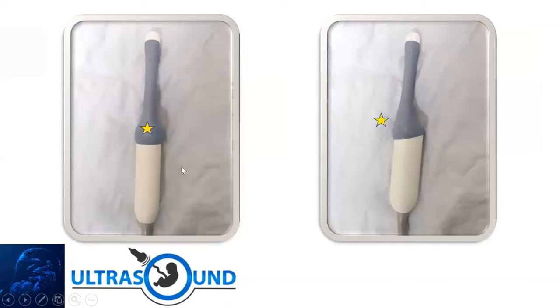So how about transvaginal scan? If you can see here, there is actually a small marking. All right, so that will be telling you this. You always have to remember where the marking is.